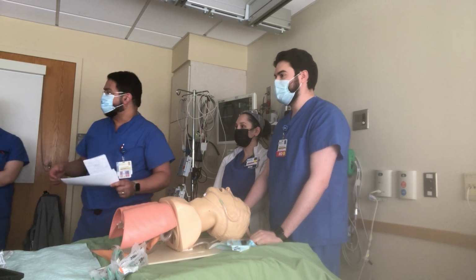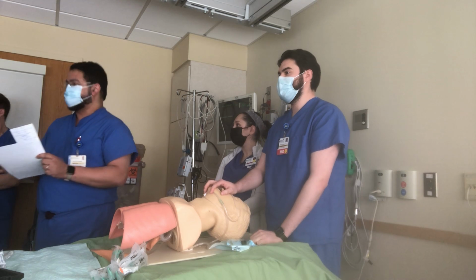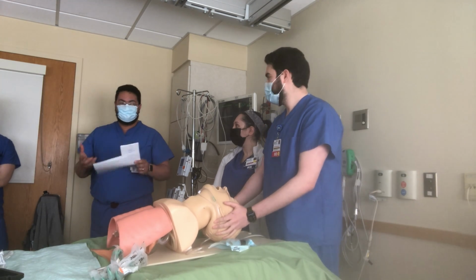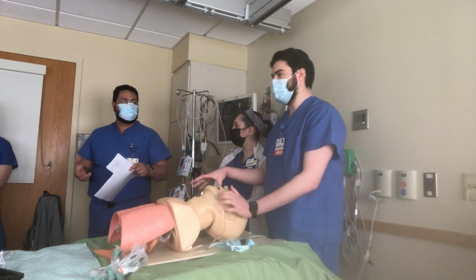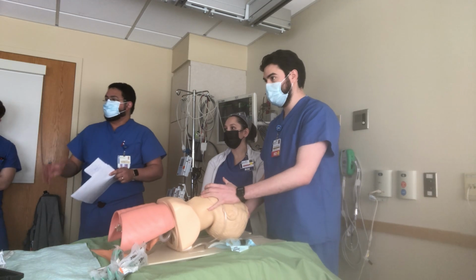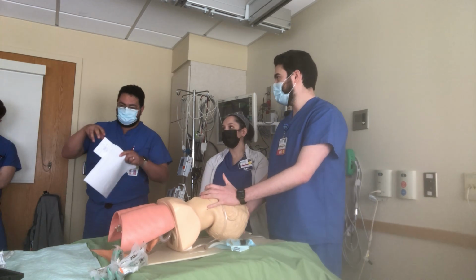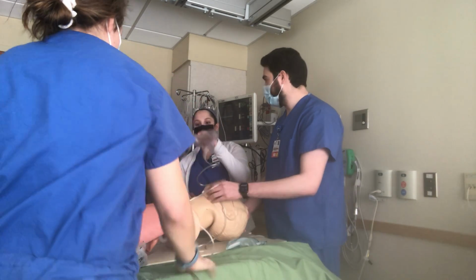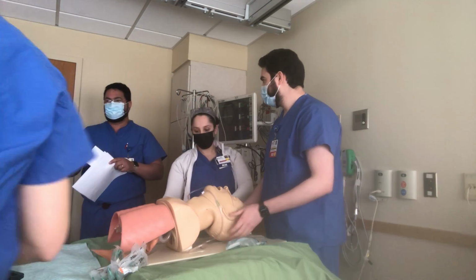So what is the glide scope? Can we bring the glide scope, please? Meanwhile, as you're getting the glide scope in, what are you holding in your hand? Ambu bag. So please, the ambu bag. And as you're doing that, before you put it on the face of the patient, you're trying to assess what? Well, no, we assessed all of this.